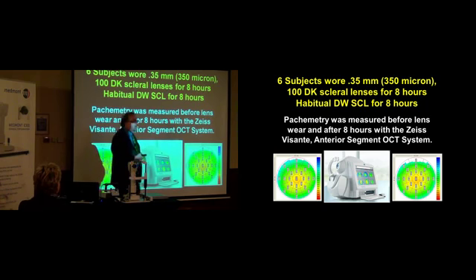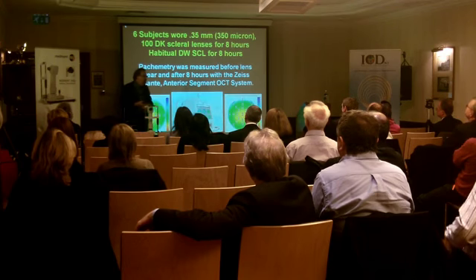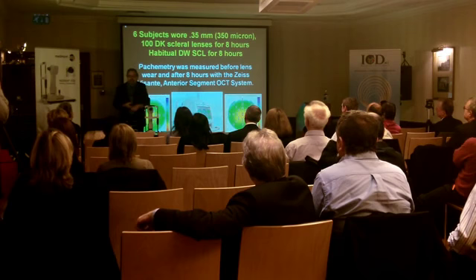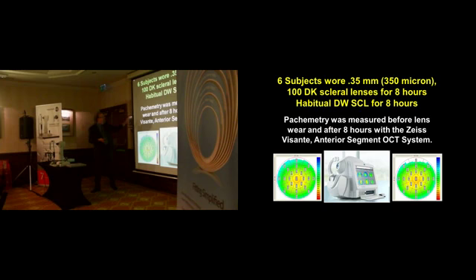Right now, today, we're initiating a study in our lab where we're fitting a group of 6 first-year optometry students with PMMA scleral lenses to see how much they swell. And we should get some intriguing results. I'll probably hear the screams over here in England. But nonetheless, it's a wonderful way of studying oxygen permeability.